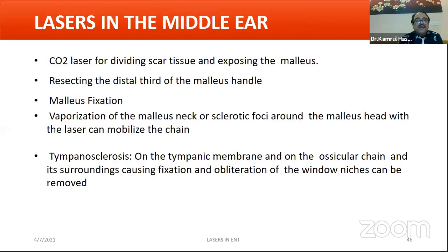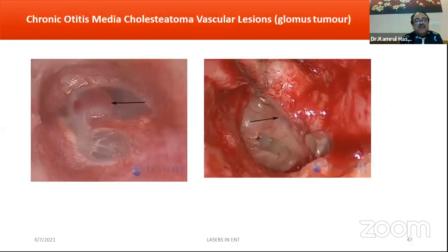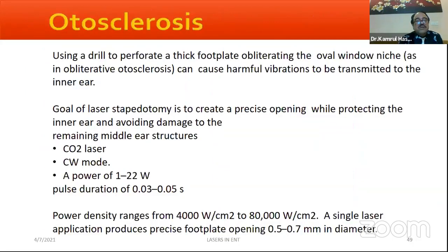Laser is used for dividing scar tissue, exposing the malleus, especially in the otosclerotic patient, resecting the distal third of the malleus, and malleus fixation, vaporization of the otosclerotic foci. In tympanosclerosis, easily we can do it if someone is equipped with this surgery.